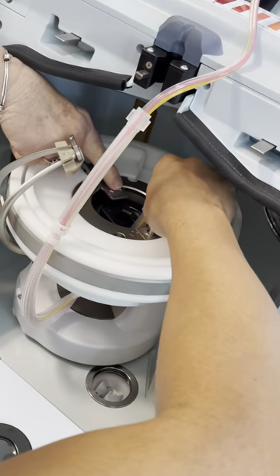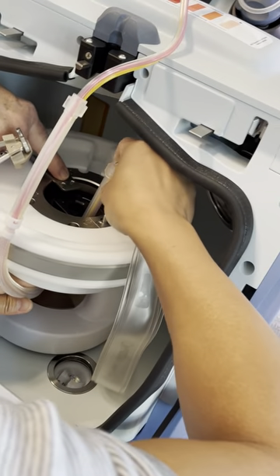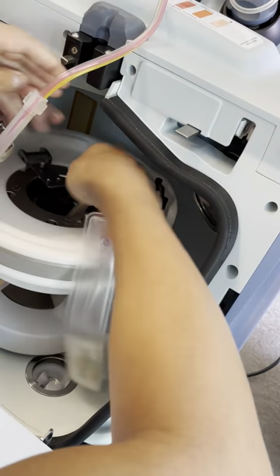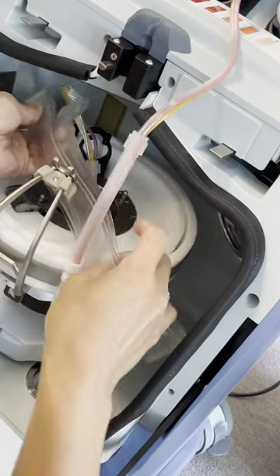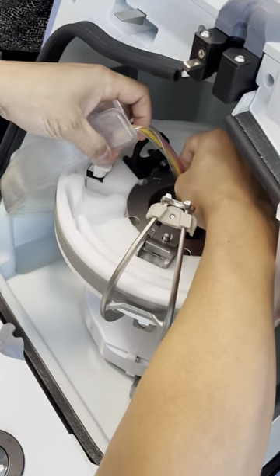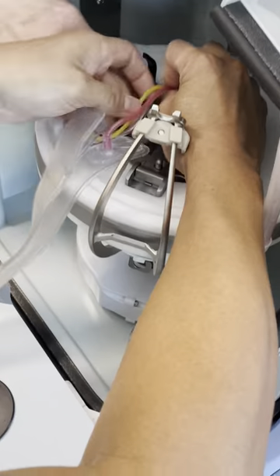Now get that red tube sitting right between the two screws here. Red tube — the collar, yeah. Let me just put this right; it'll be easy. It should be between — exactly. Bring the collar above.